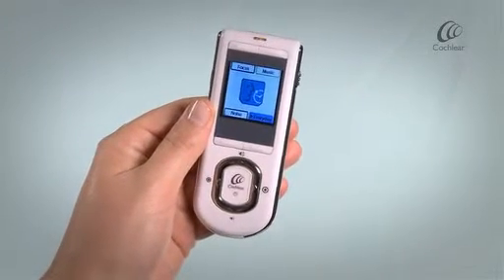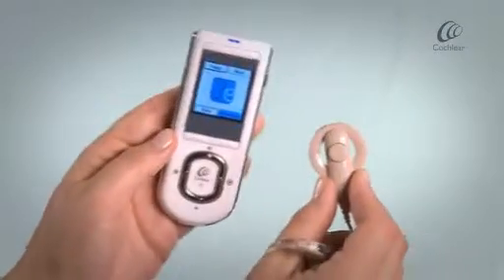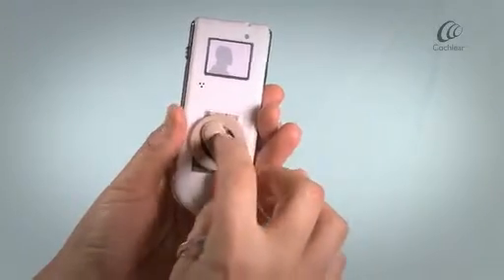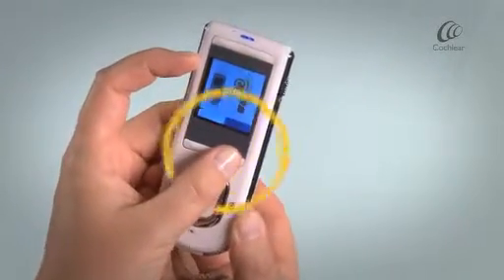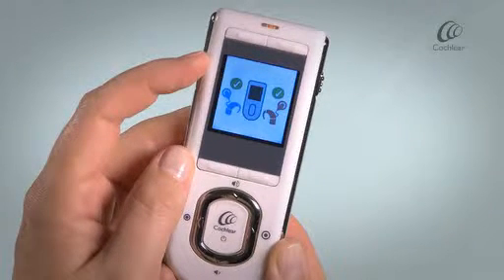Remove the coil from the back of the remote assistant. Repeat the same steps to pair your second processor. A confirmation screen will indicate the devices have been paired.